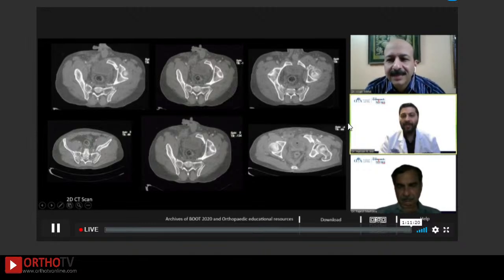I think that through the AIP, really, that helps you to reduce that crescent fracture, actually pushing from the inside of the pelvis out to lateralize at the sciatic buttress at the front of the SI joint. And between that and your lateral window, try to get it secure, potentially a small plate there to help secure it. But I think your major fixation for that crescent is going to be an LC2 screw starting at the anterior inferior iliac spine and going towards the PIIS.